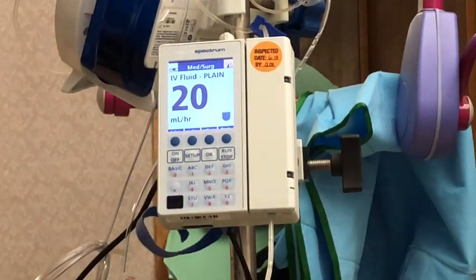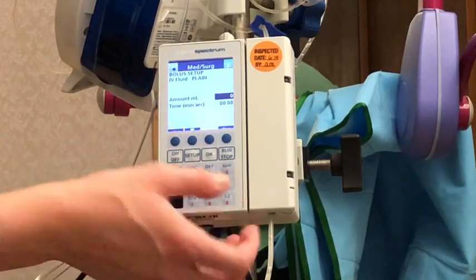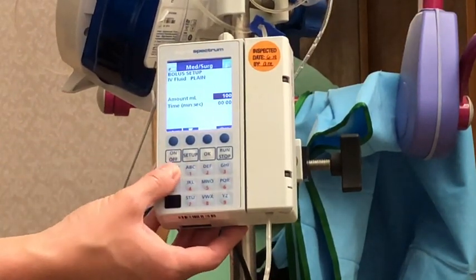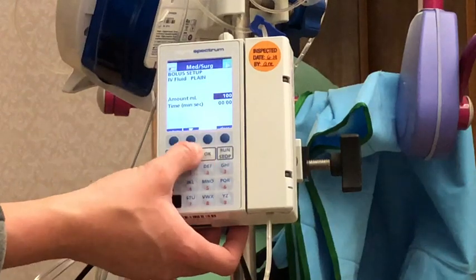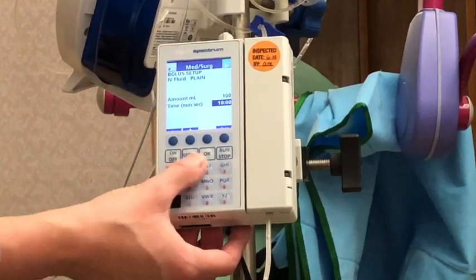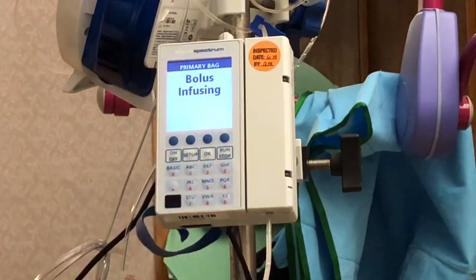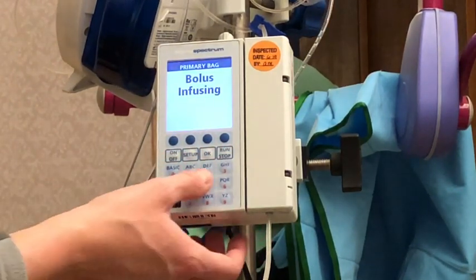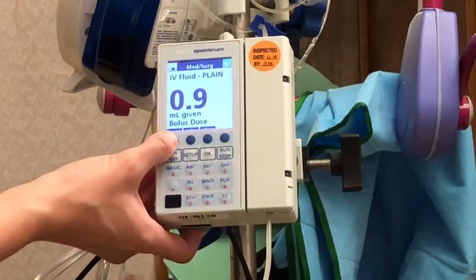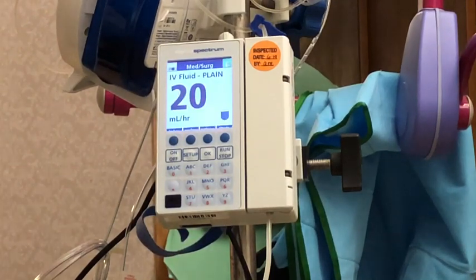If I wanted to run a bolus, I can hit bolus and put in my amount — I'll say 100 cc's for this example — and hit okay. For the time, I'll put in over 10 minutes and hit okay. Then I press run to start the bolus and it will start running. I'm going to go ahead and cancel that bolus just for the sake of the demonstration, and now we're back to our primary infusion.